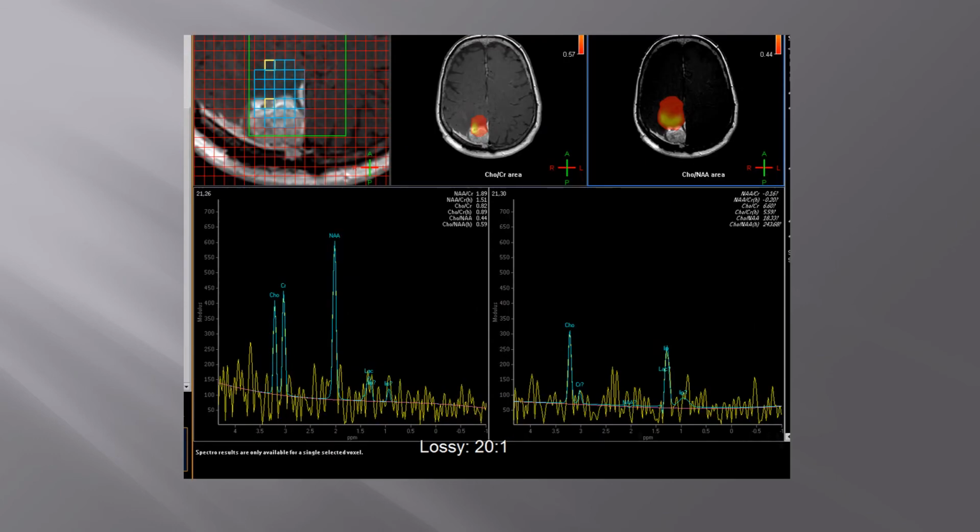If you look at spectroscopy, you also have a moderate tumor spectrum. Actually, the perfusion performed better here. Maybe the spectrum didn't because you have a lot of things possibly degrading your spectral quality. You're right up against the calvarium, so you're at the brain soft tissue interface. Spectroscopy is very sensitive to interface differences, but in general, your spectrum in the lesion does have an elevated choline.